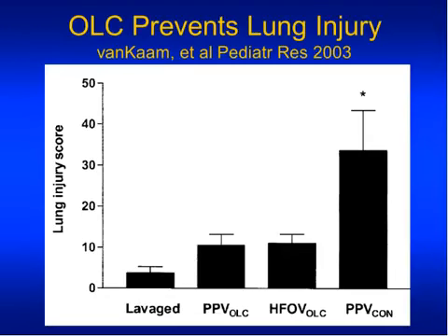And you don't have to wait for a blood gas. This gives you an early warning that something isn't right, so you go and check on the baby, see what happened, whether the tube slipped into the right mainstem bronchus, whether there's some occlusion, atelectasis, pneumothorax, who knows what. Maybe an overdose, maybe the nurse gave a little too much morphine and the baby stopped breathing. Lots of possible reasons. We just need to sort it out.